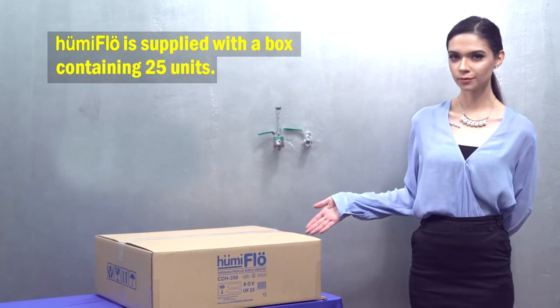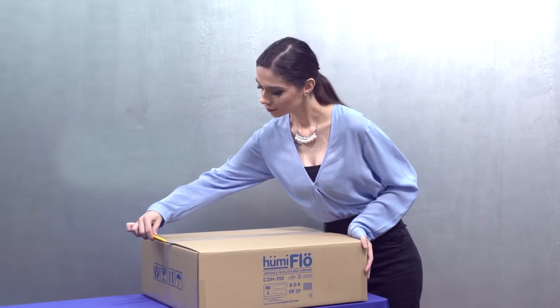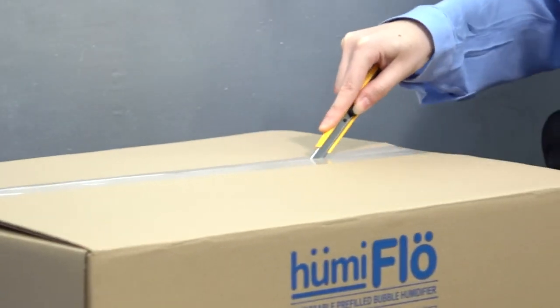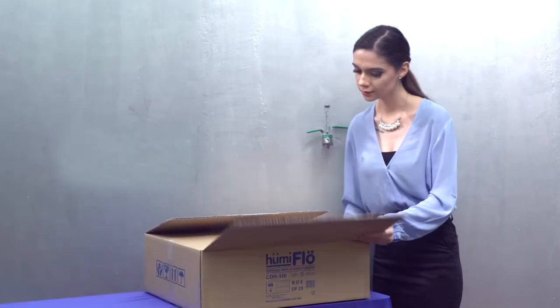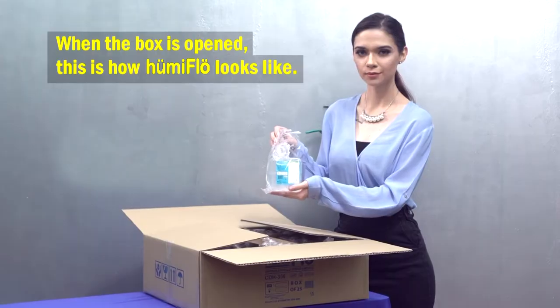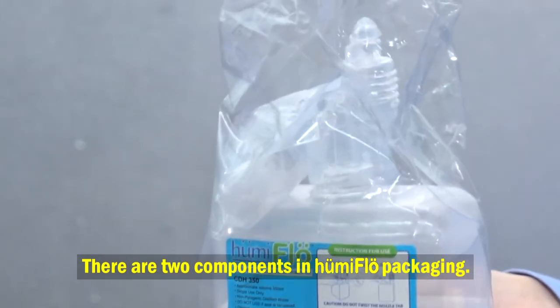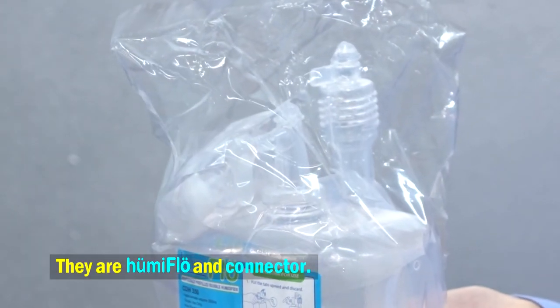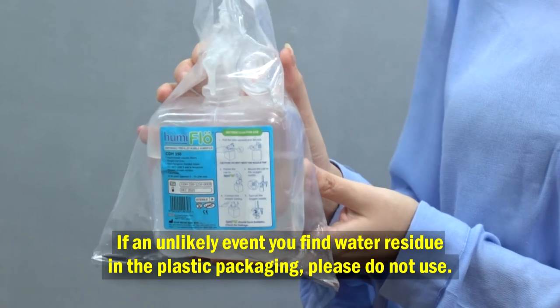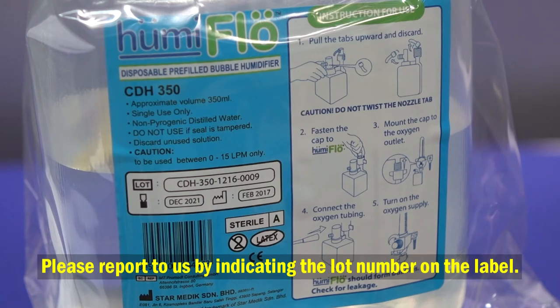Humiflow is supplied in a box containing 25 units. When the box is opened, there are two components in the Humiflow packaging: the Humiflow unit and the connector. Make sure Humiflow does not leak. In the unlikely event you find water residue in the plastic packaging, please do not use it and report to us by indicating the lot number on the label.